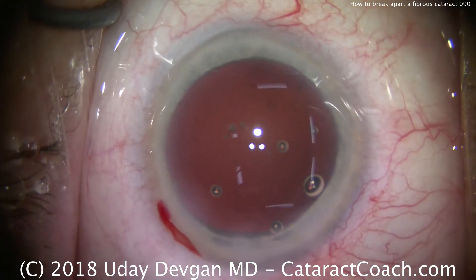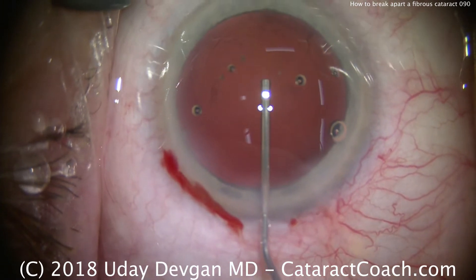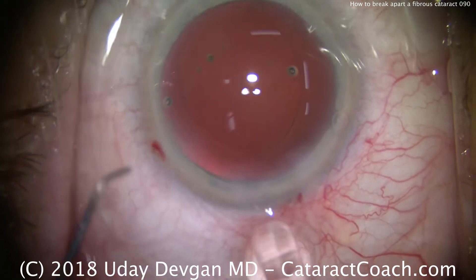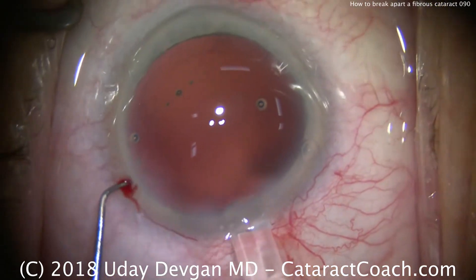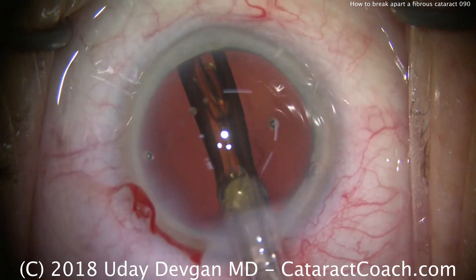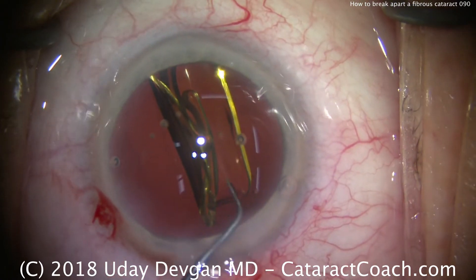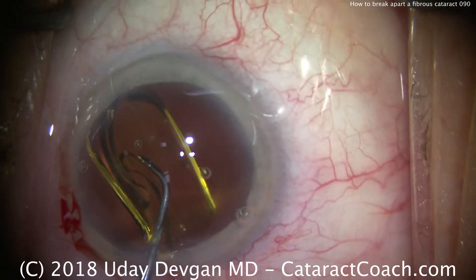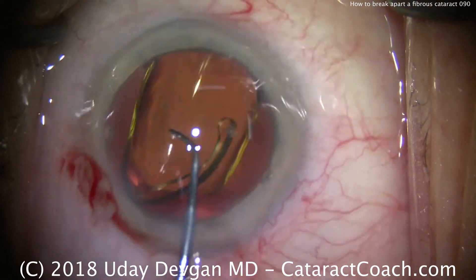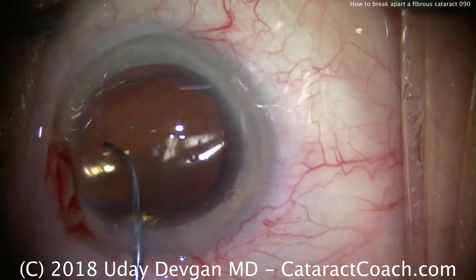Now the capsular bag is empty. We're going to fill it up with our cohesive viscoelastic — there's the big fill coming in. We're going to put our lens in the capsular bag. It's a single-piece acrylic monofocal lens. Fixating the eye, we'll advance the lens down the injector, open up the lens within the capsular bag, and then rotate the lens to position it in the desired meridian. You can also see that the rexis does overlap the optic for 360 degrees, so we've achieved our goal there.